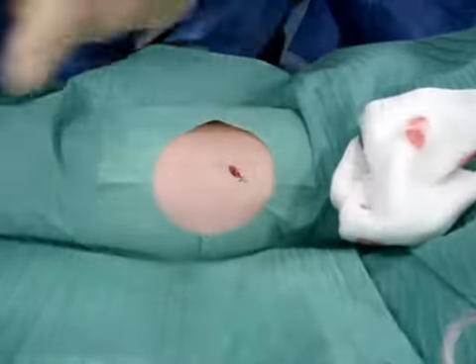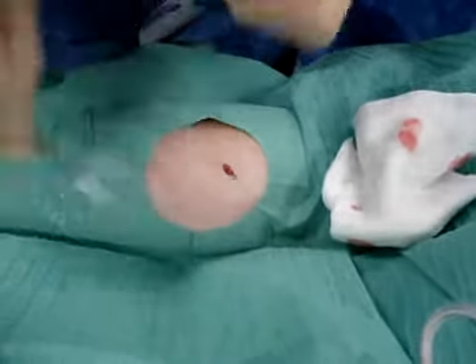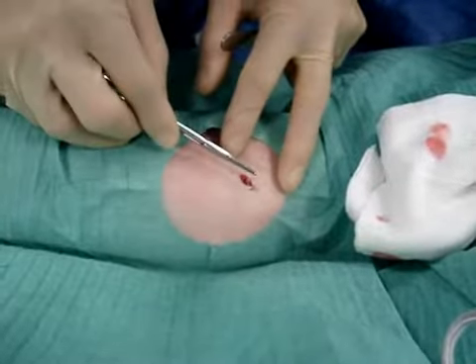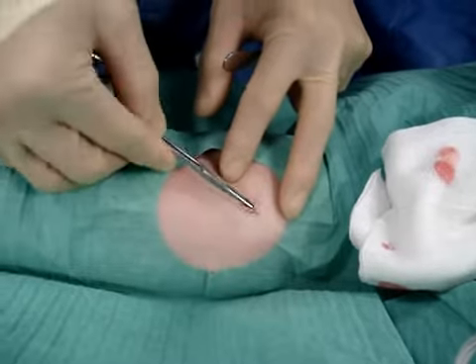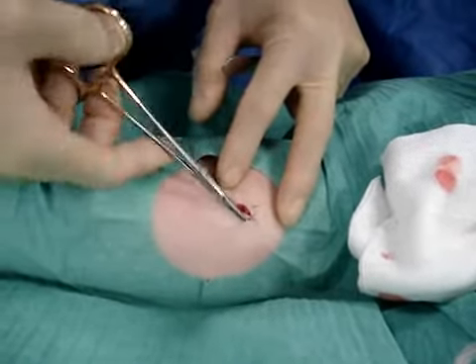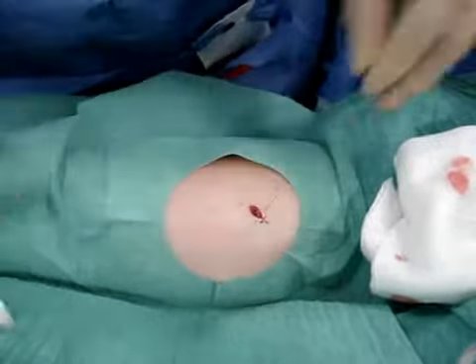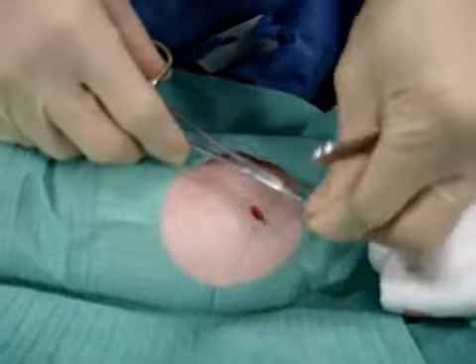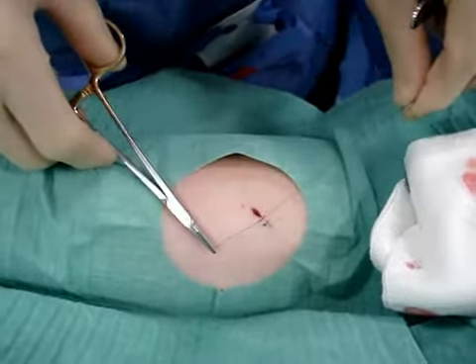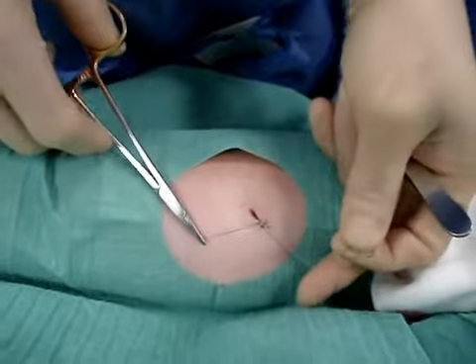You enter the skin at the right angle, holding it using a palming method. You angle in, come out the same distance. The first knot is a double knot, so you do it twice — one, two. Then pull the skin together.